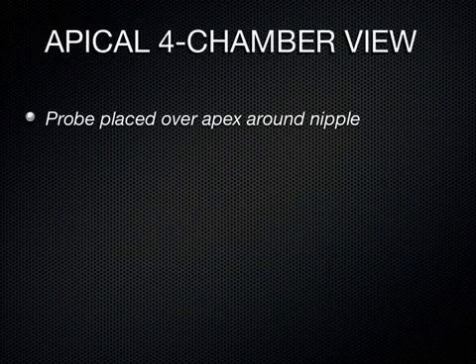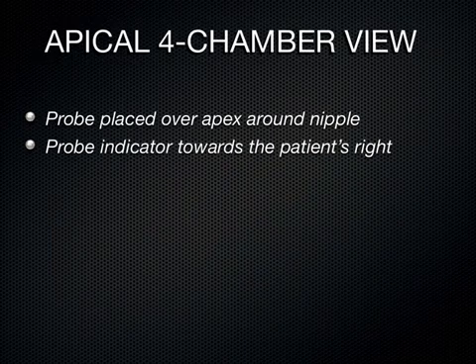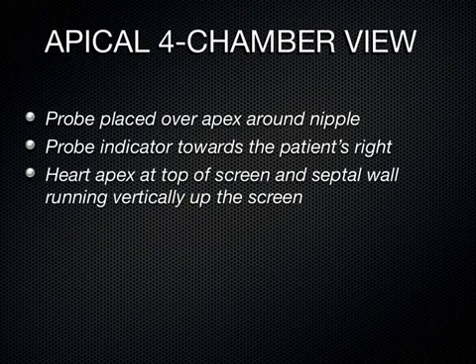It's particularly difficult in women with large breasts because you have to move the breast out of the way to get to this little view here. So this is one you're going to struggle to obtain, but it's the one that gives you the most bang for your buck. You're going to place that transducer just inferior to the nipple line and lateral, in that area down there by the nipple, with the indicator to the patient's right.